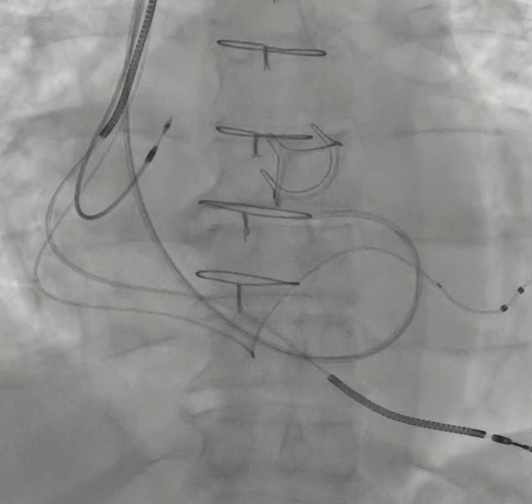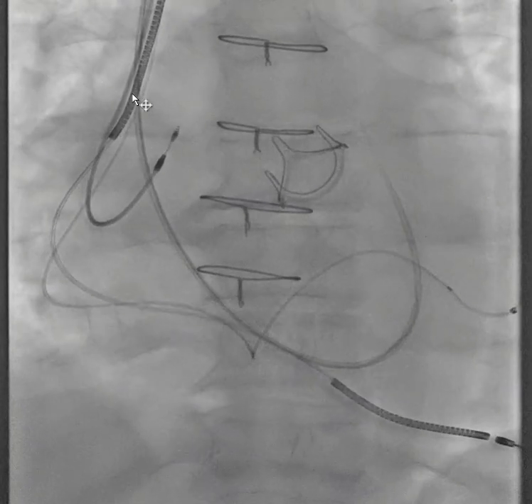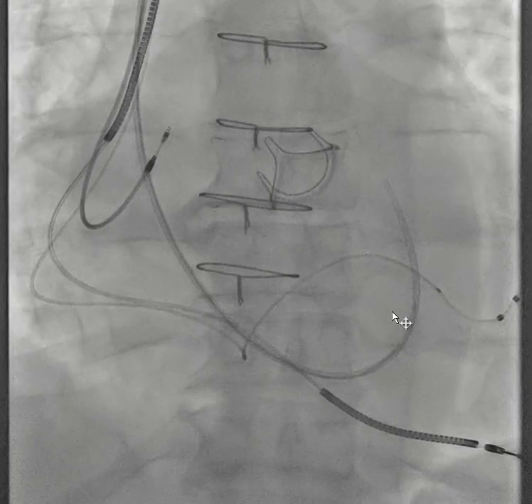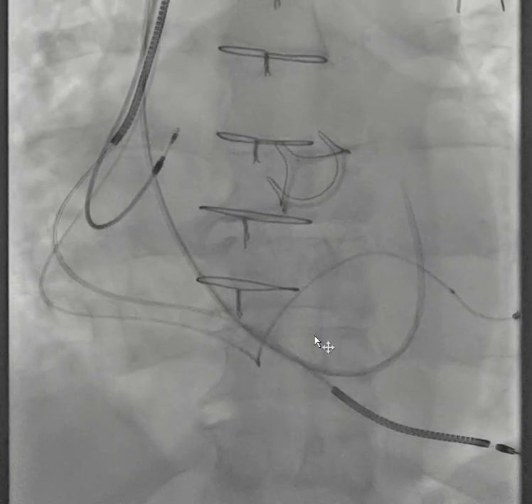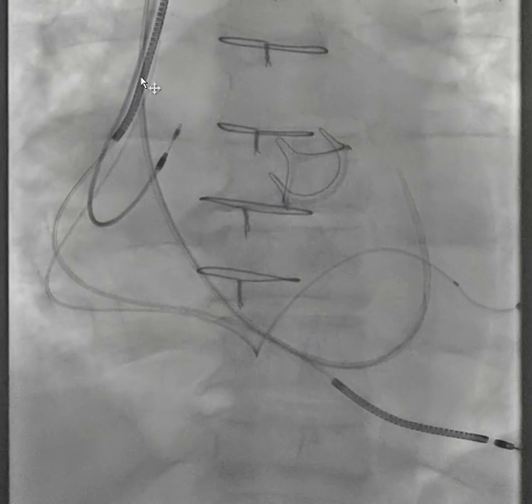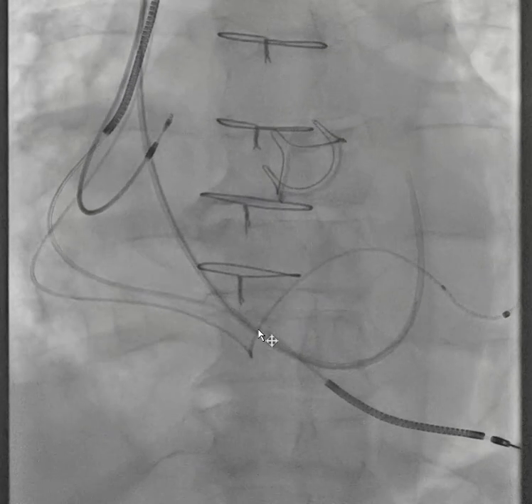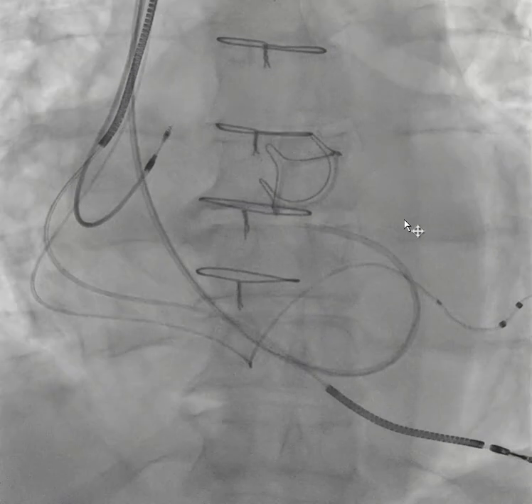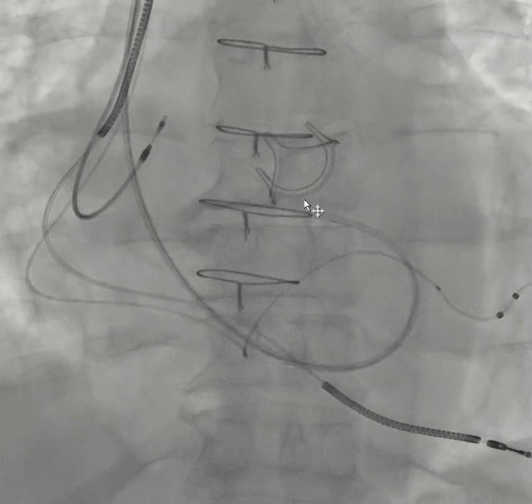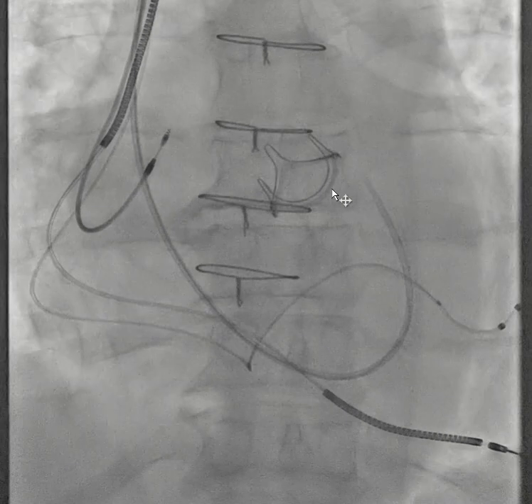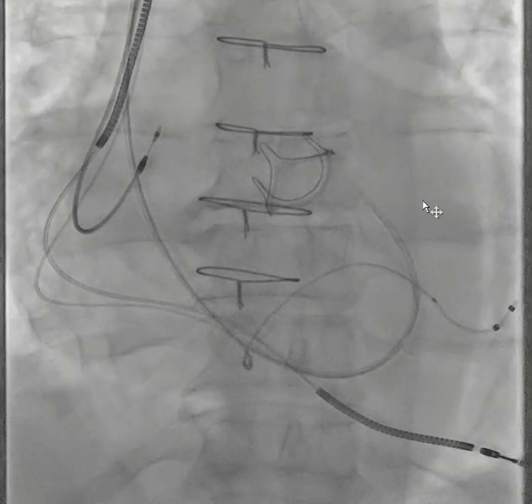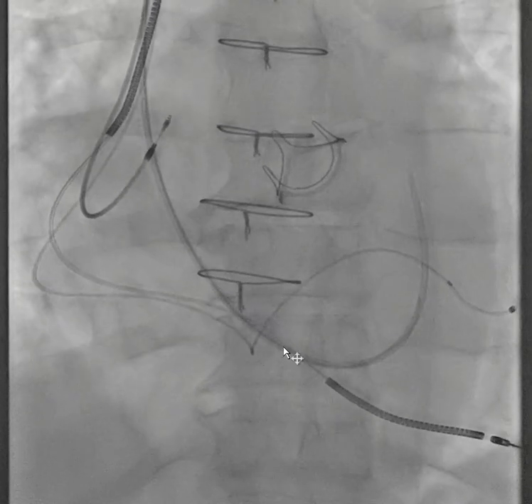This is a case where I was doing a right ventricular biopsy. To get a sheath in there, I put a wire through an Arrow 7 French catheter and used the same technique. There's a balloon inflated here, and as soon as it's deflated, it jumped into the right ventricle.